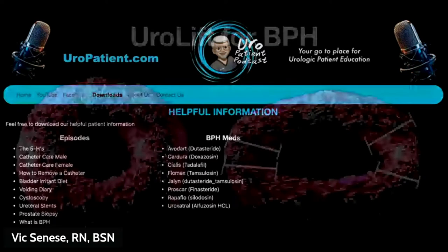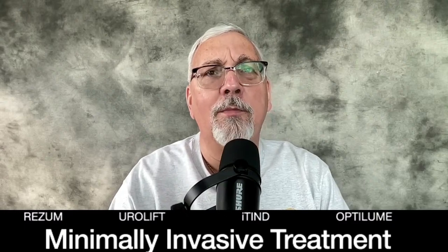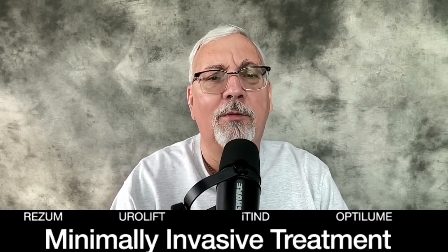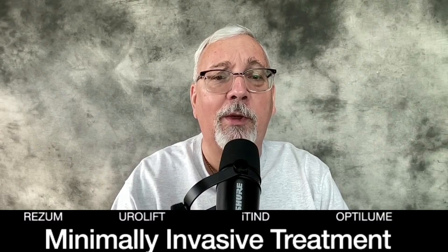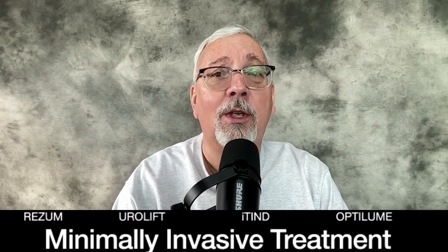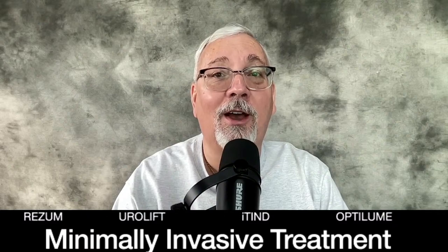Today we're going to be continuing our journey on BPH treatments. We've done medications, we did Rezum last week. Now we're going to look at Urolift. As I talked about the prostate looking like a donut, well, if that hole gets too small, you can kind of staple it open — just like you see there. So these are what we call our minimally invasive therapies, and that's what we're talking about today. We have ITIN and Optolume still to do.